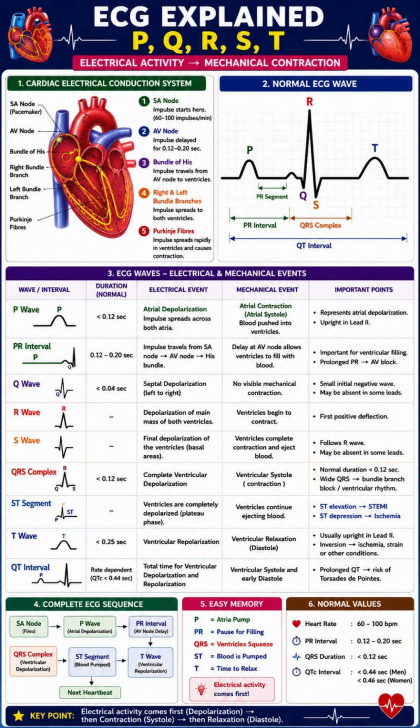ST segment. The ST segment is the period when the ventricles remain completely depolarized and continue ejecting blood into the pulmonary artery and the aorta. Clinically, this segment is very important. ST elevation may indicate an acute myocardial infarction, while ST depression may suggest myocardial ischemia.